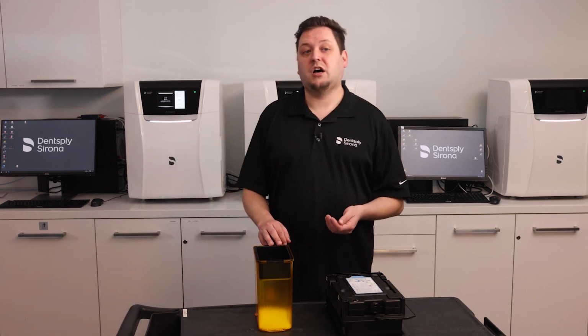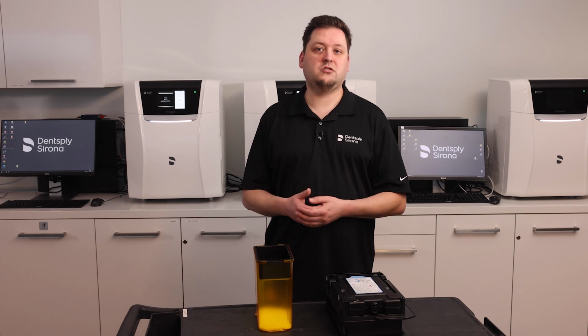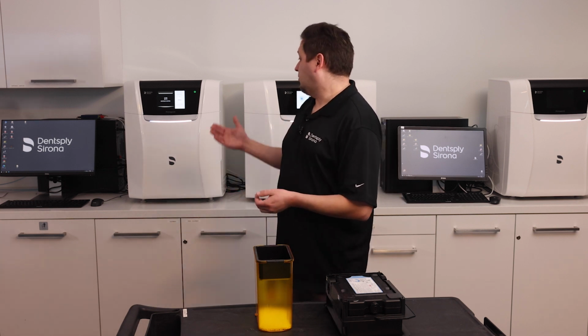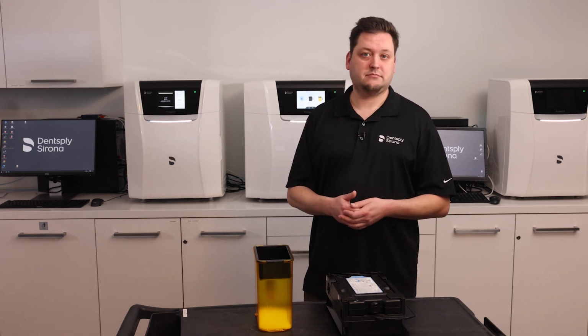So it's up to you to decide, is preheat worth saving those 5 to 15 minutes? As long as you're going to use the resin that you've preheated, maybe it's a choice for you. Either way, once preheat is started, the Primeprint is now ready to print.